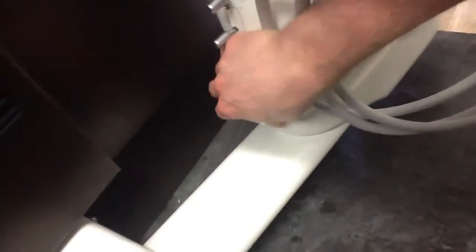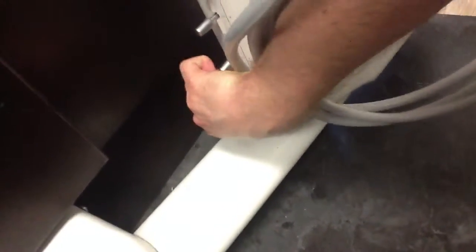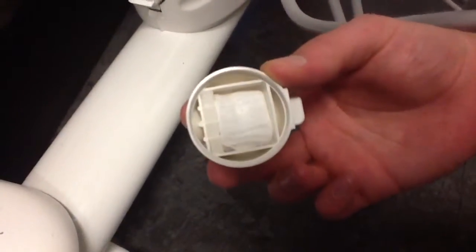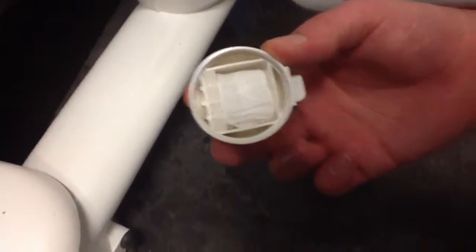Okay. And this little cap down here, I'd like for you to just remove it from bottom up. Just pull it from bottom up. See, it's got a little lever on the bottom. Yeah, just pull it. Now if you look inside of there, now the cap itself, you see it's got a 2x2. I do. And that's where all of your exhaust goes into.